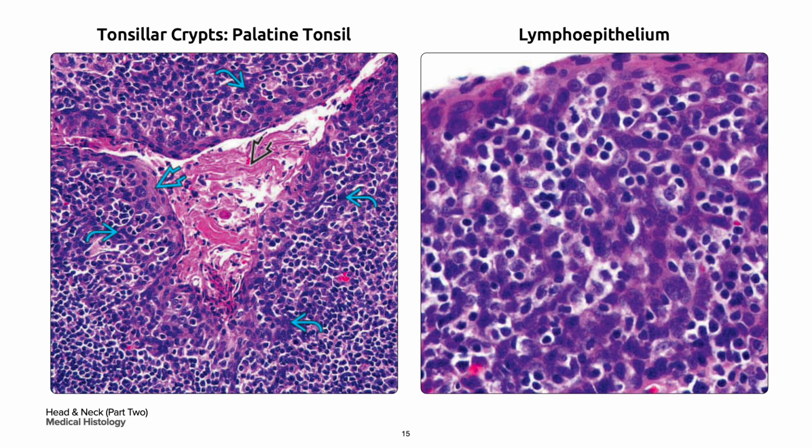On your left is a crypt epithelium, which is distorted by infiltrating lymphocytes and plasma cells, which impart a reticular appearance. These squamous cells are predominantly basaloid, shown in the curved blue arrow. The surface has a thin layer of differentiated keratinocytes, in the bold blue arrow. Although non-keratinizing, desquamated squamous cells often accumulate within the crypts, pointed out in the bold black arrow.